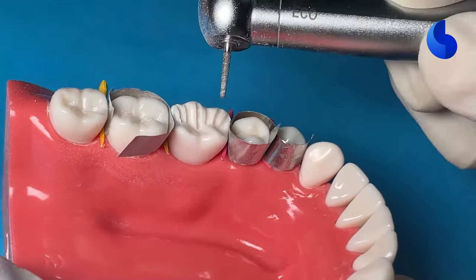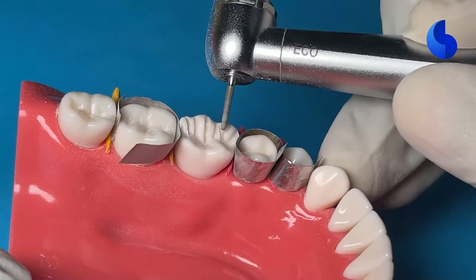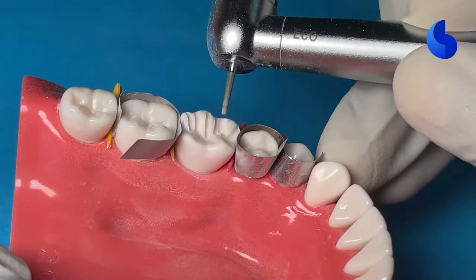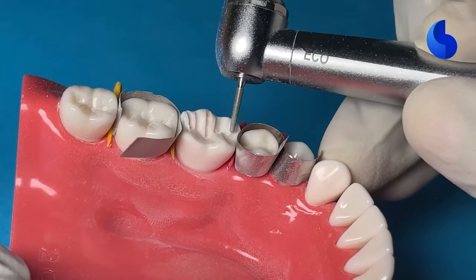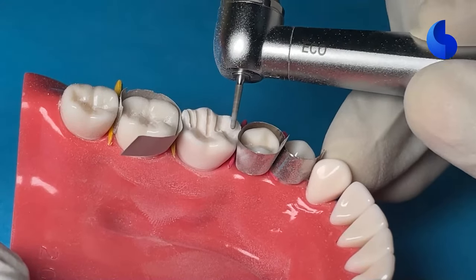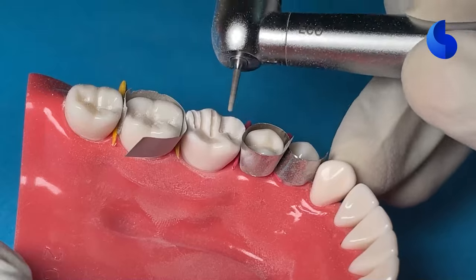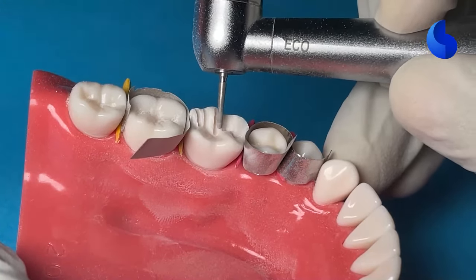So as you can see, after we created the depth orientation groove, we are now trying to remove those islands of tooth structure between the depth orientation grooves so that you can bring it down to the level that you want it to be. So for an all-ceramic crown preparation, you want to have at least 1.5 to 2 millimeters of occlusal reduction. It's always better to err on excess rather than insufficient reduction. All-ceramic crowns require a lot of body for the ceramic so that it doesn't fracture, which is why you need that much amount of tooth structure removed.